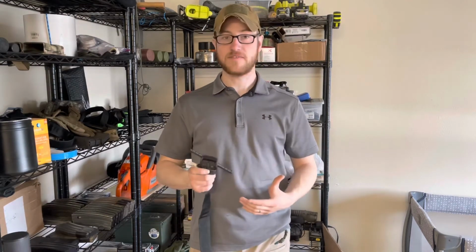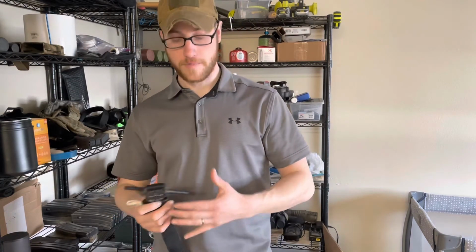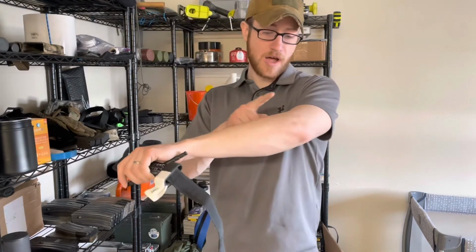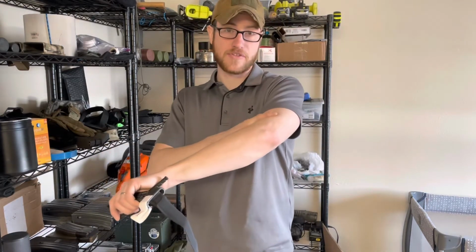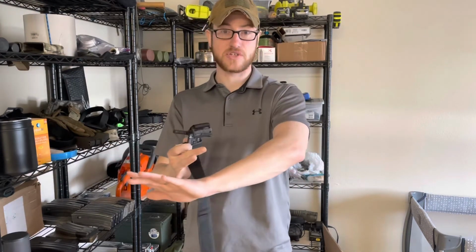You're not going to have time to sit there and assess where that blood is coming from. So instead of sitting there and being like, oh, it's right here, I need to go 3 inches above, oh, there's a joint there, I need to go above the joint. Instead of doing that, you're just going to put the tourniquet on high and tight. That gives you the most probability of catching and controlling that bleeding. And then you'll bring them back.